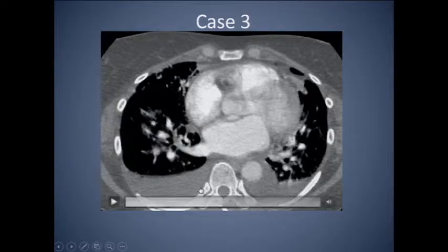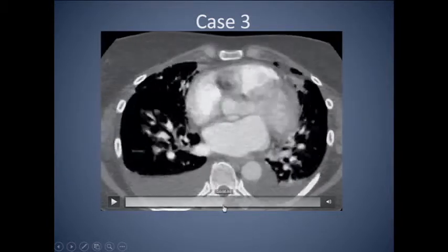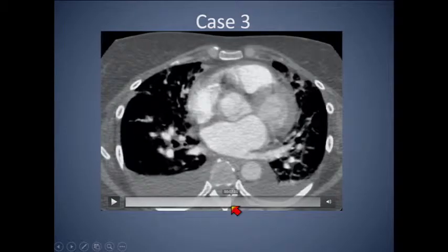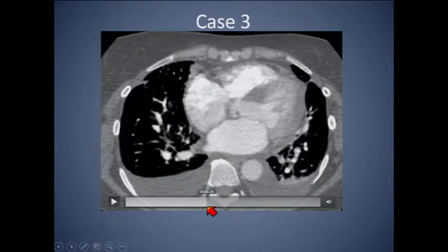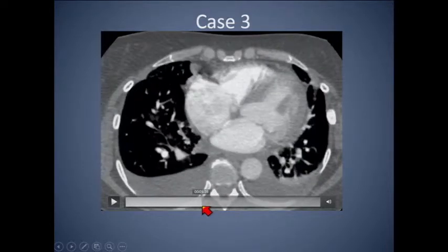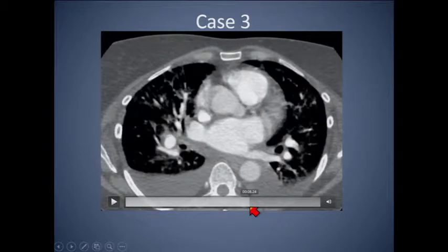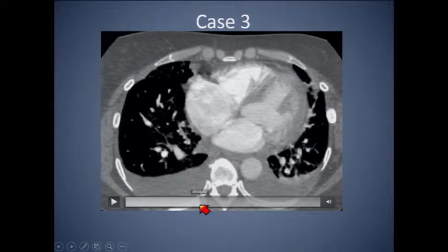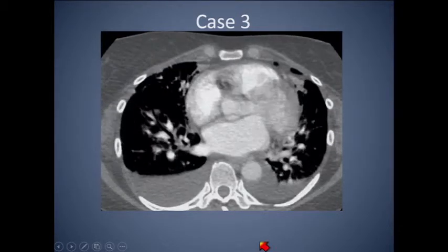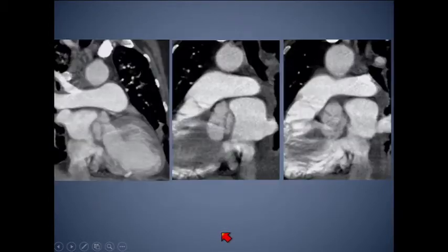And if you look and you follow this little tubular collection, here, let's see if I can do this. Follow this little tubular collection. We see this collection interposed between the aorta and the LA. It wraps around. It actually takes the course of what you usually see for an anomalous circumflex, but there's her circumflex coming off her left main, reading through all the motion. You've got to read what you're given. And we see this collection. It looks like it goes towards the RV. So we were the first to suggest, we really think this lady's got endocarditis and has a paravalvular abscess.